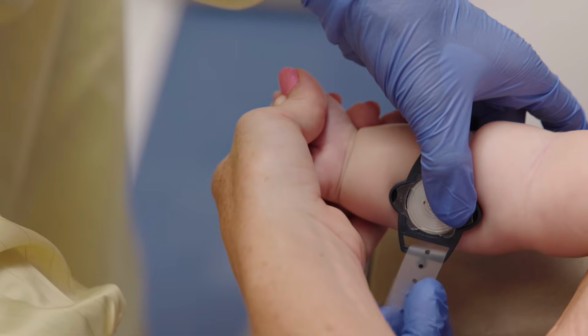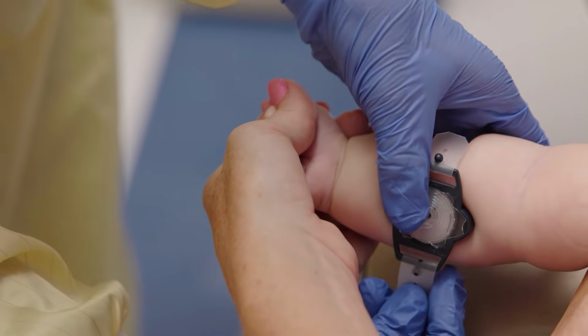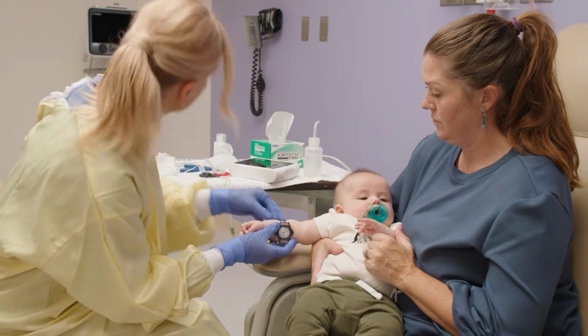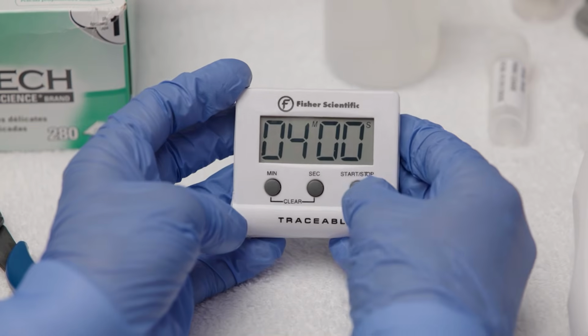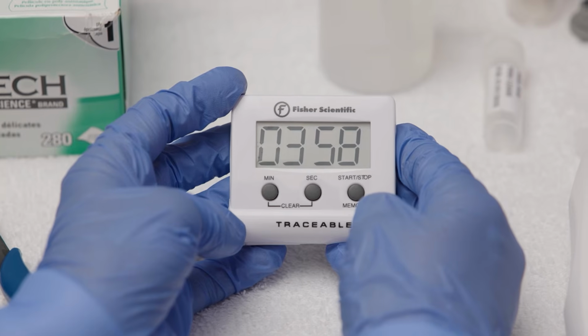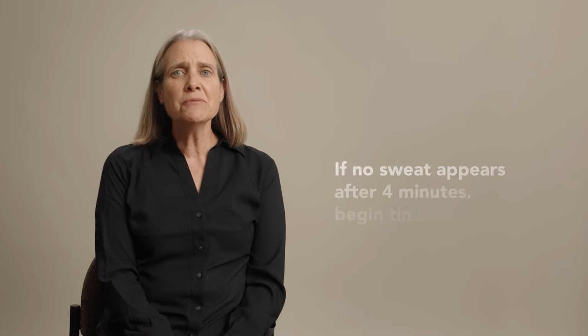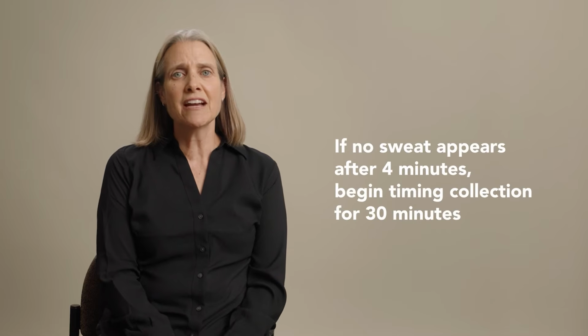Make sure the collector is flat against the skin. There should be small pillows of skin showing on each side of the collector. Start a 4-minute timer and watch for sweat to appear in the coil. This is the blue dye seen in the coil. If no sweat appears after 4 minutes, begin timing the collection regardless for 30 minutes.